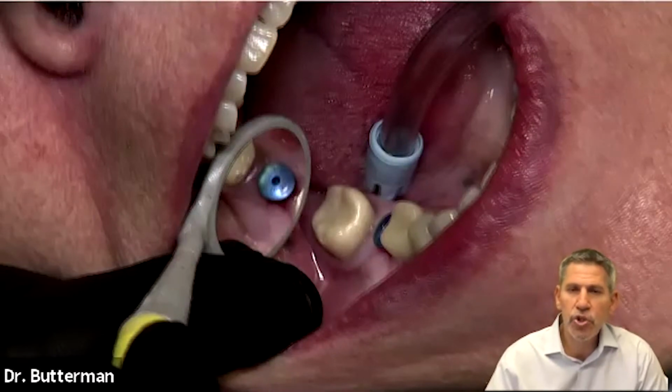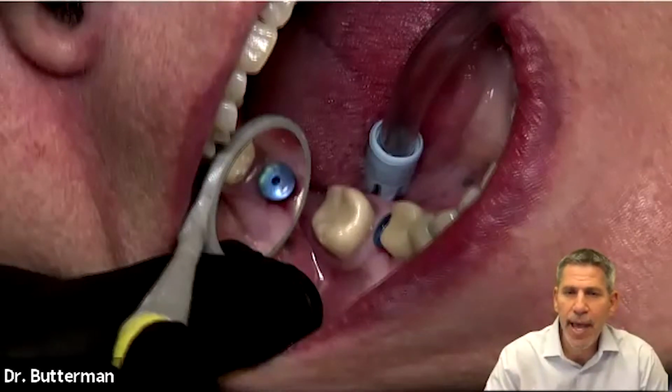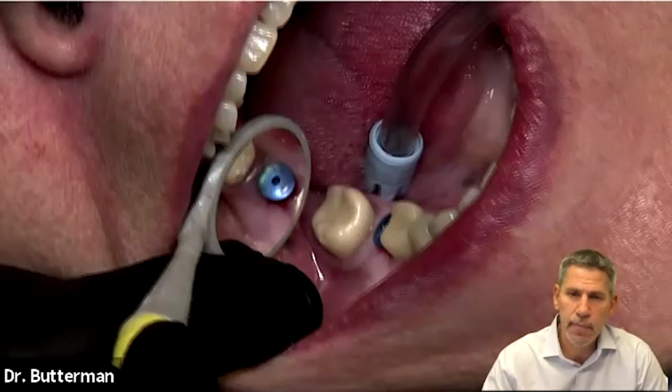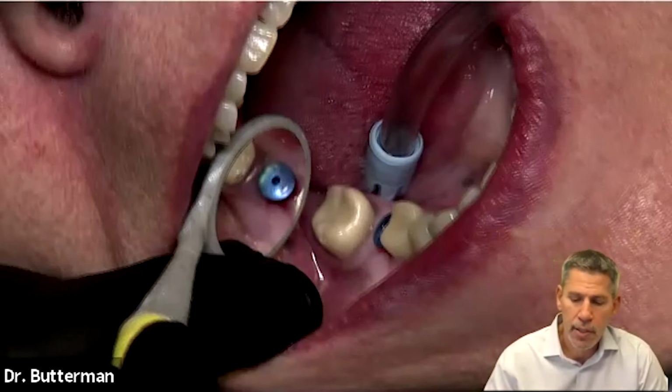How long does a surgery like this take? If I showed you this video in real time, which I have, the entire surgery from anesthetic until she gets up to leave the office is 20 minutes. And how much stress is involved in that? Well, really none, because I already know how this is going to go. I've already done the surgery digitally.